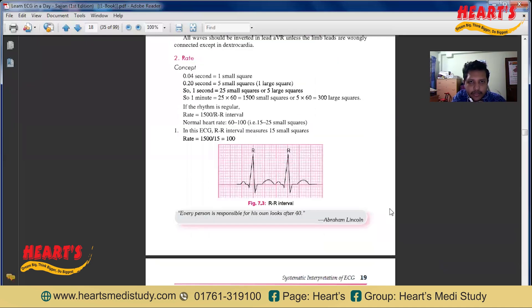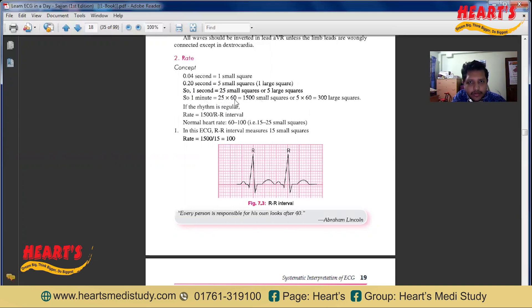In an ECG paper, one small square denotes 0.04 seconds, and five small squares denote 0.2 seconds. So one second is 25 small squares, meaning the paper runs at 25 small squares per second, or 5 large squares. Therefore, one large square equals 0.2 seconds. Accordingly, one minute will be 25 × 60 = 1500 small squares, or 300 large squares.